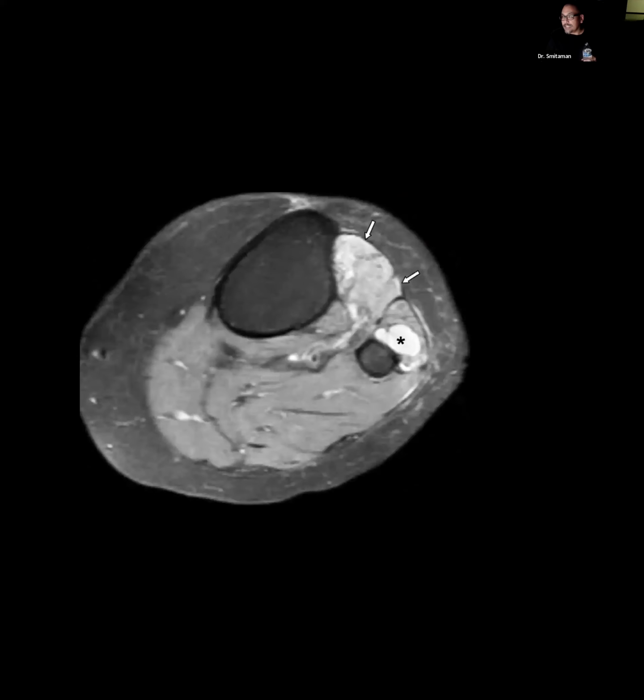Or how about this case? Let's look more distally. Soft tissue ganglia or synovial cyst along the anterior aspect of the fibular neck or proximal shaft, likely dinging the common peroneal nerve and its branches, as we can see here with the edema involving that anterior compartment of the proximal lower leg in this case.